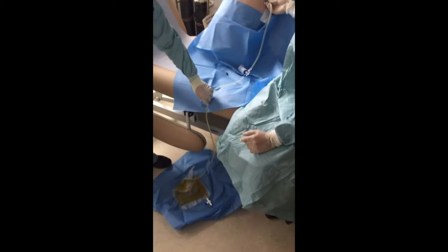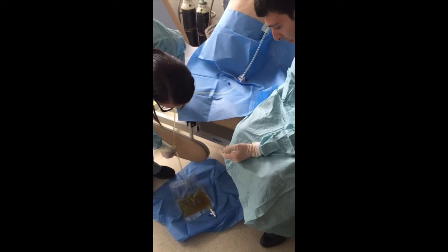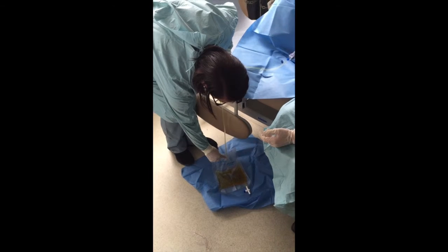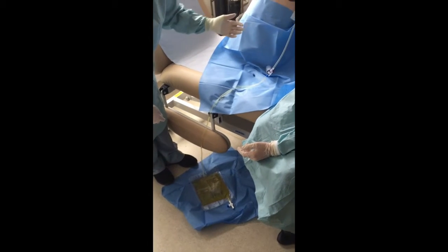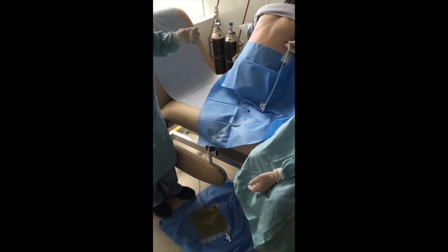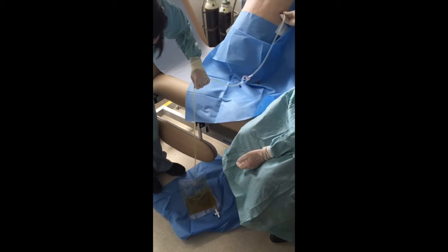Okay. It's often quite hard to see in these bags, but if you sort of lift up here and look at the flow down here, you can just see a flow coming down. And you have to imagine that this cannula is a small bore tube, so it's going to take longer to drain than a normal chest drain, which would be bigger. Yeah. So that's all draining nicely then.